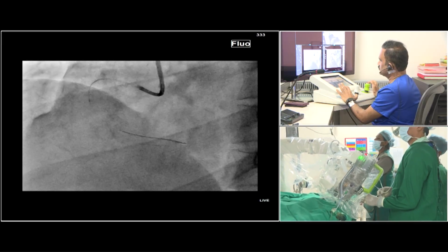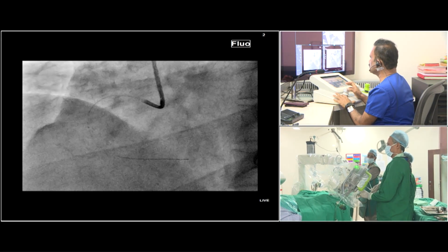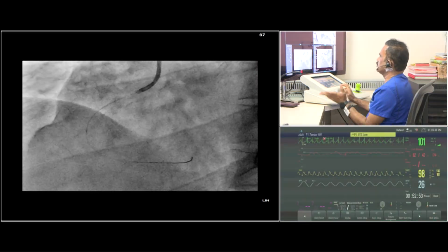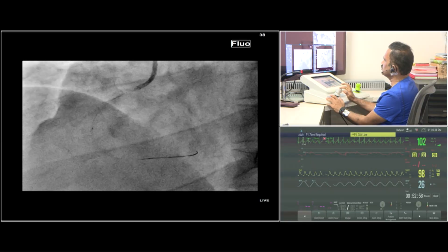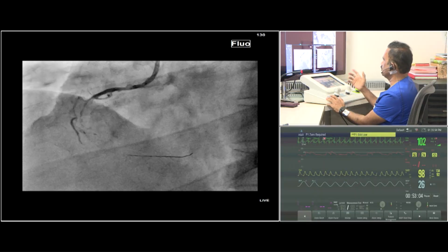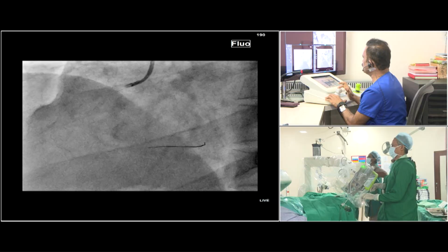Catheter. I think I'll take a balloon slightly downward. Yeah, you can dilate it here. I think we have dilated the lesion very well. You can see the movement of the balloon, the 1.25 by 8 balloon going through the lesion very well. I'll remove the 1.25 by 8 and we'll have to go with a bigger balloon.